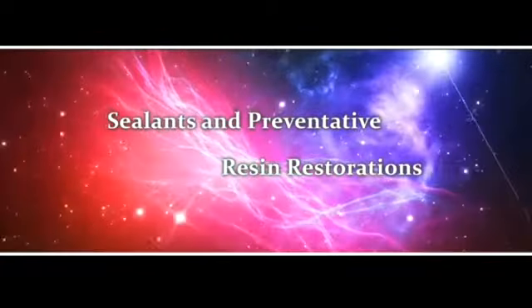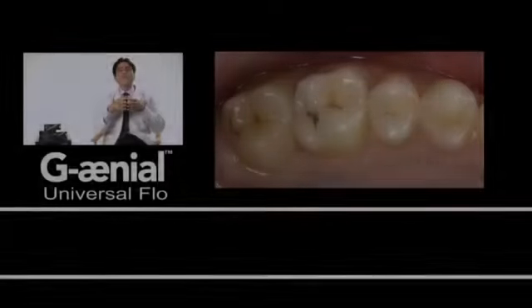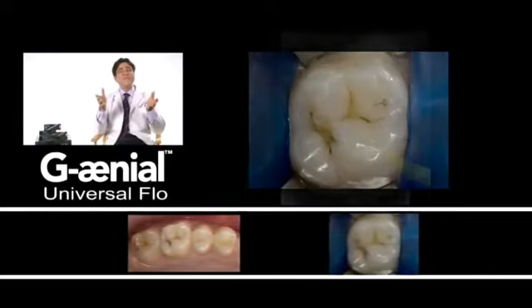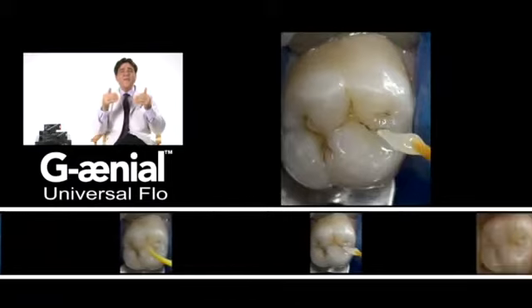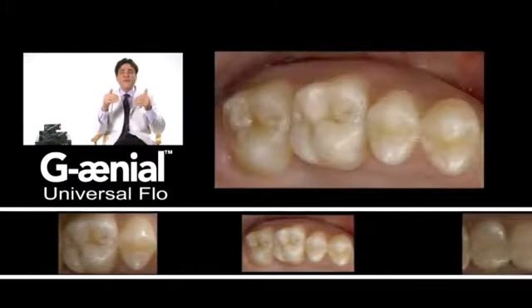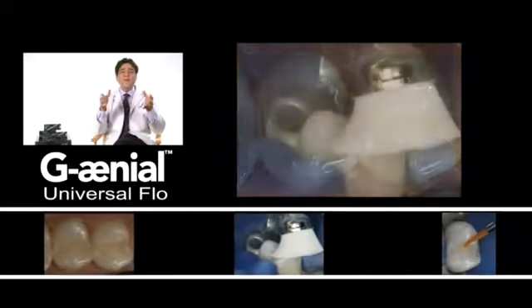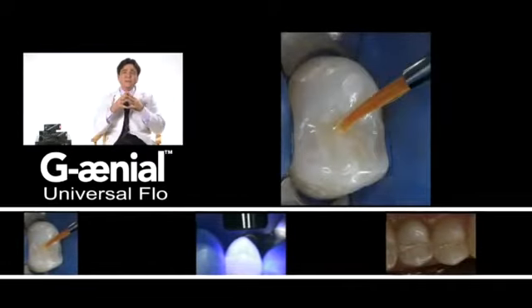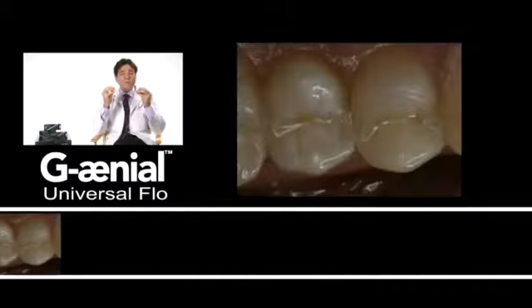As sealants and preventative resin restorations, next-generation flowables can be utilized as composite surface sealants, pit and fissure sealants, and preventative resin restorations. These highly filled nanomaterial formulations can be cured in a thin film and have the potential to increase the wear resistance of posterior composite resin restorations, since the interparticle spacing is reduced and the filler particle density is increased, and thus can provide more reinforcement and protection of the resin matrix.